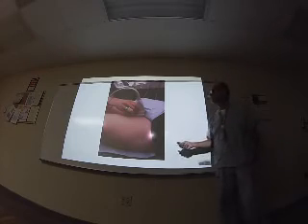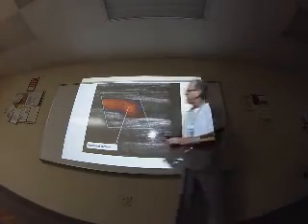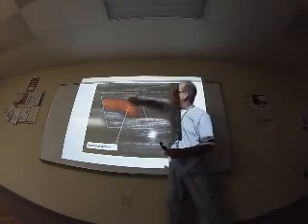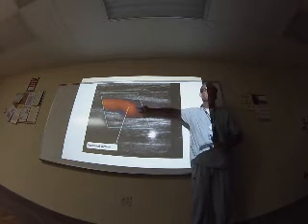What transducer do we use for echocardiography? Phased transducer. Okay, you can see here the color Doppler. Remember, this is a B mode, and in the color Doppler, the machine puts color where the blood is moving.